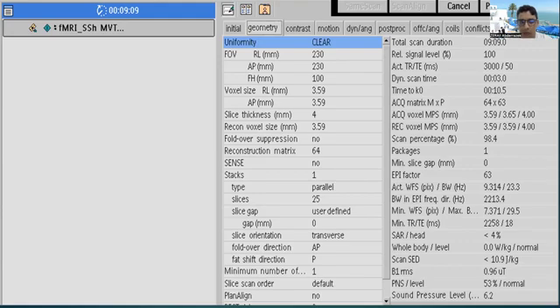For example, you have your FOV. The voxel size is around 3.4 or 3.5, with a good orientation, posterior orientation. The slice thickness you can work with is 4. For the fold-over, there is no need to use a fold-over direction. The reconstruction matrix is also 64. There is no need here to use SENSE, to minimize the time of acquisition. The stacks you can set to 1. The slices go through 25 or 30, depending on the brain that you scan.